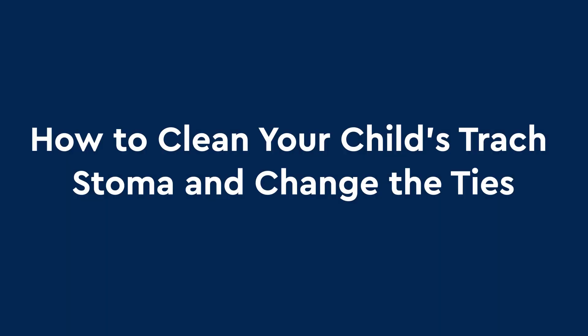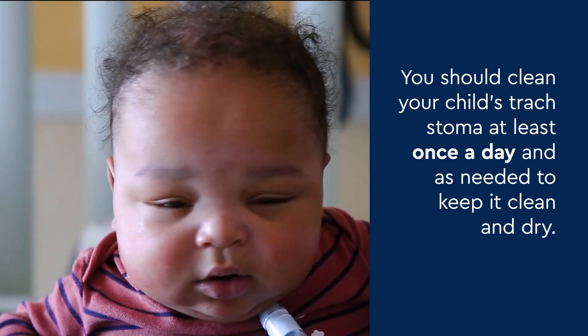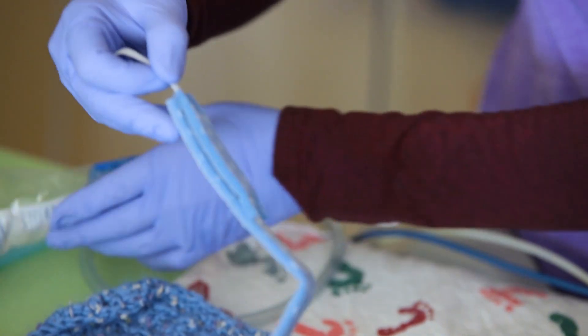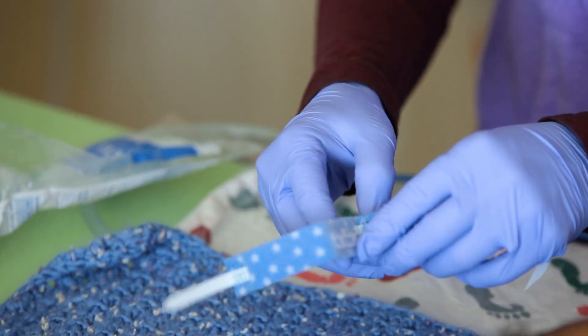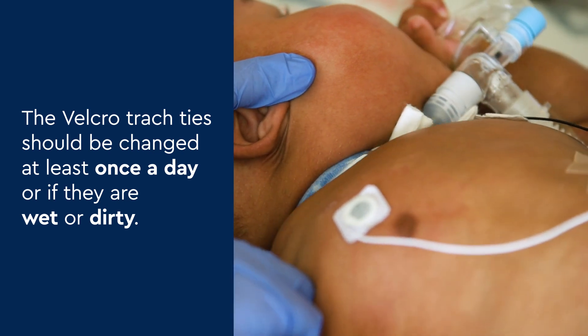How to clean your child's trach stoma and change the ties. You should clean your child's trach stoma at least once a day and as needed to keep it clean and dry. The velcro trach ties hold the trach in place and should be changed at least once a day or if they are wet or dirty.